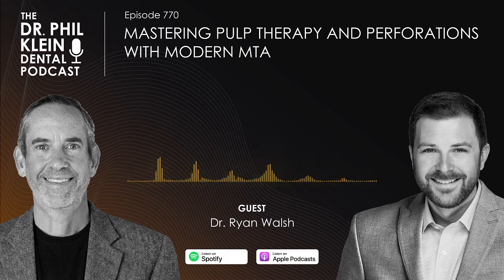Yeah, so if a general dentist, not that endodontists never perforate, but let's put it on the GP. So they're taking on a case that maybe they should have referred out, and they got a little bit endodontically ambitious, and they perforated number 30 on the side, going down one of the roots. Small perforation, and they bypassed it, and they got down to the canal apical foramen area, and they were able to do all their endodontic treatment. But they still see some blood as they're drying the canal. There's a little bit of seepage of blood in the coronal part of one of the mesial roots. What do you do clinically for that?